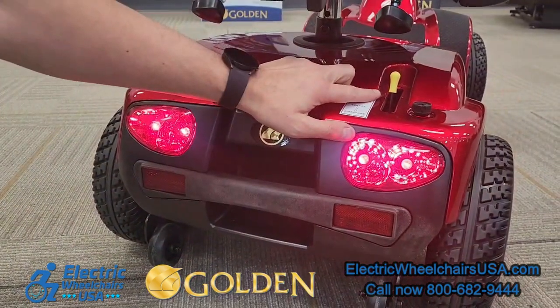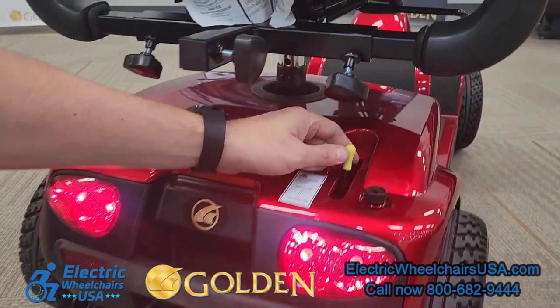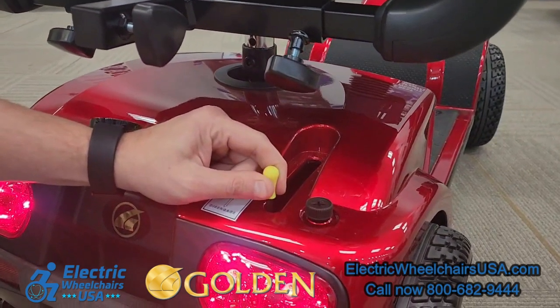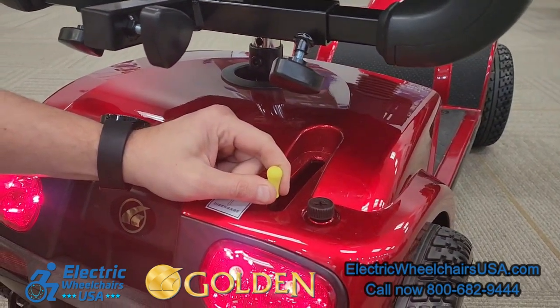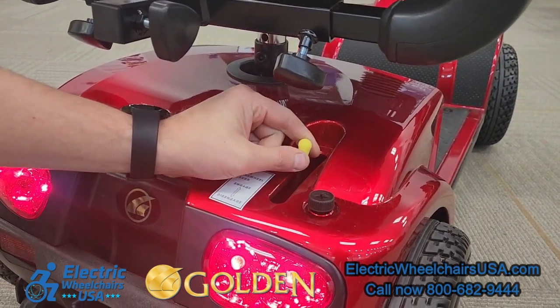This yellow lever is the freewheel lever. When you pull the lever back, it puts it into a neutral position, so if the battery happens to die, you can push the scooter back to your destination to charge. Otherwise, you can't operate when it's in neutral — it does have to be in the drive position.